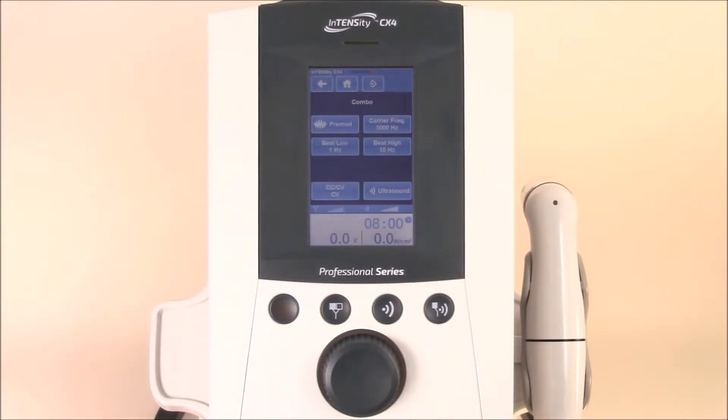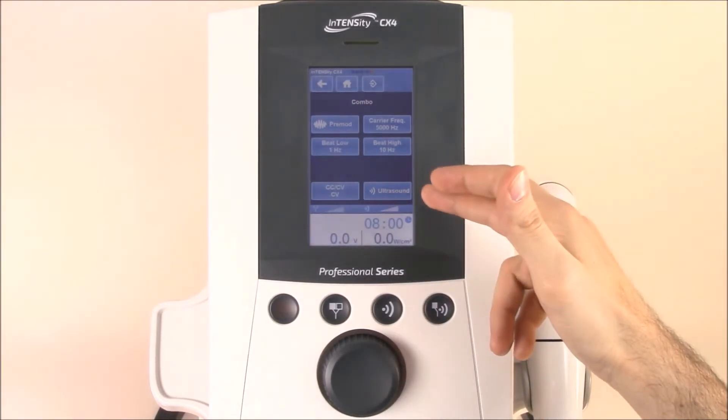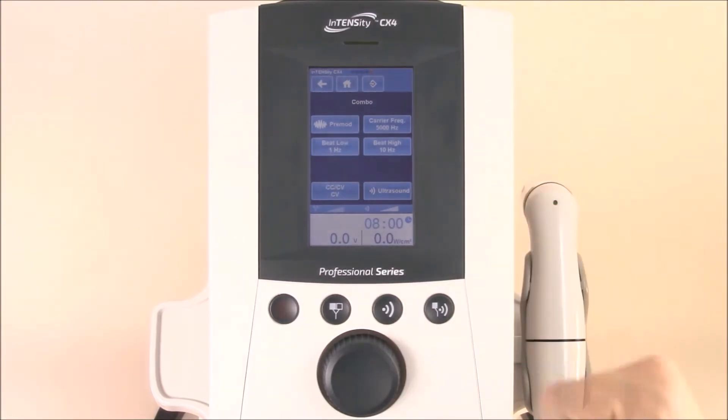If you need to change your ultrasound settings, simply hit ultrasound and adjust the settings there. Once you're ready to get started, you can control both power settings, turn on the machine, and get going.